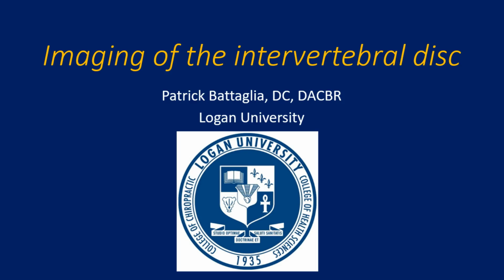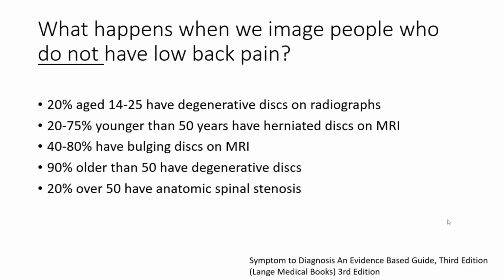This is imaging of the lumbar intervertebral disc. I'm Pat Battaglia from Logan University. Before we get into the heart of the lecture, which is imaging anatomy and pathology of the lumbar intervertebral disc, I just wanted to throw out this disclaimer, just to get this out of the way, so to speak.